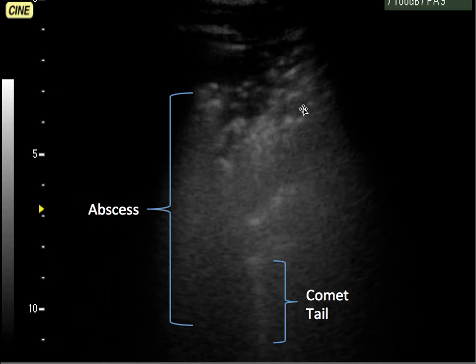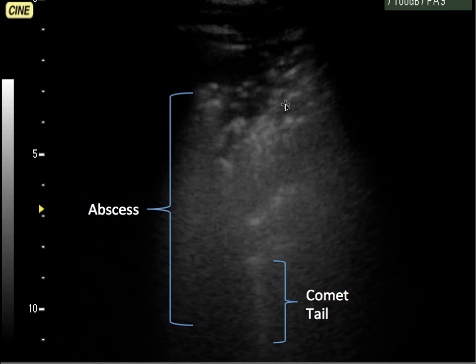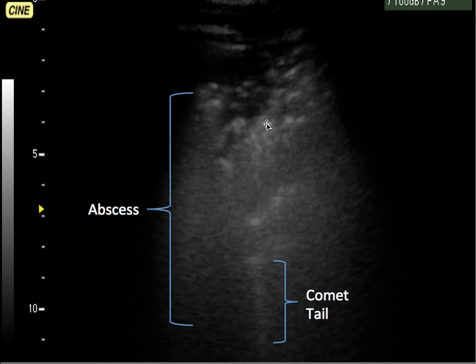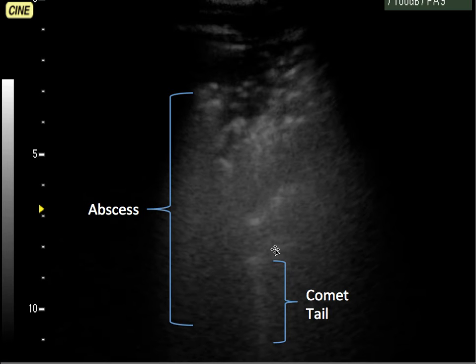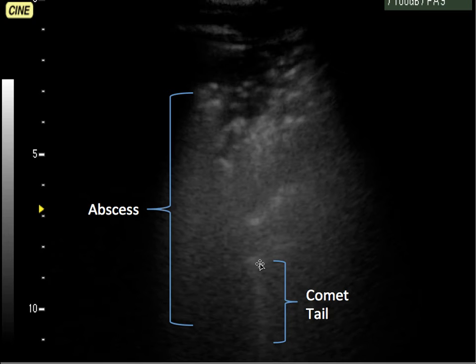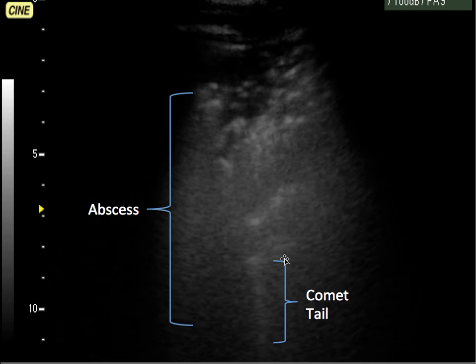This is the second abnormal image. Again, we see an abscess — a little bit different, but also looks similar to the previous image. We see the lumpy bumpiness coming around here. The next abnormality we see is something called a comet tail, which is a hyperechoic streaking that we see in abnormal lung.